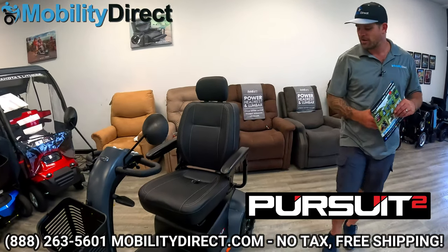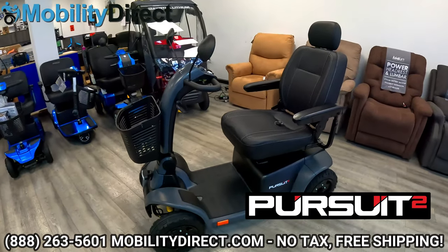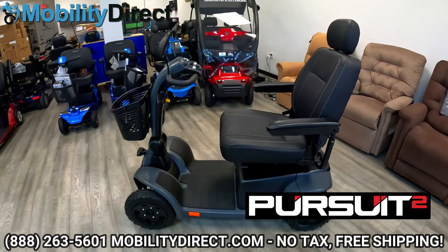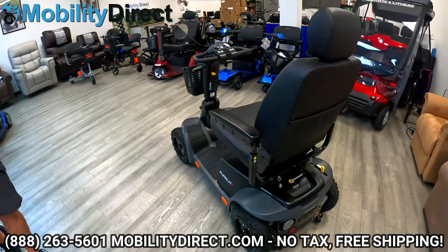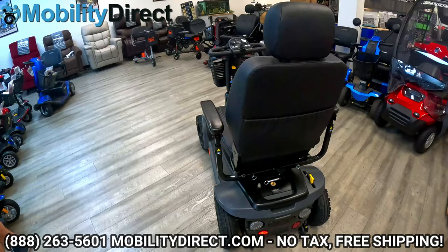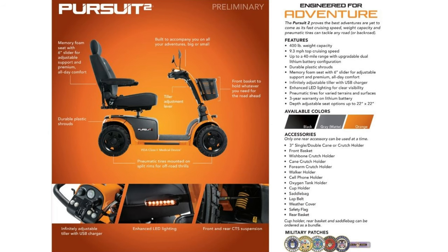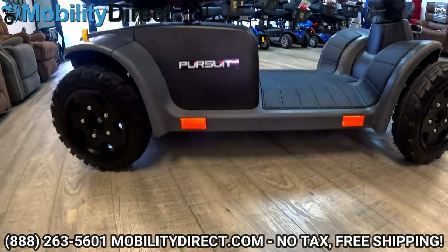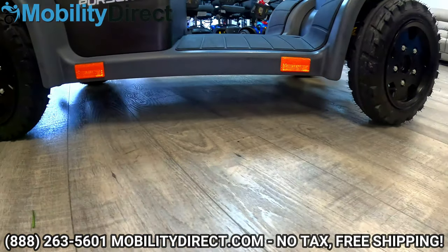Here we have the all-new Pride Mobility Pursuit 2. As you can see, it's an absolute beautiful scooter. This is model number SC7132. It has a maximum weight capacity of 400 pounds and a max speed of up to 9.3 miles per hour. At the transaxle, which is where the motor is, you have a ground clearance of 3.8 inches, and it has a really good turning radius for its size at 69.3 inches.